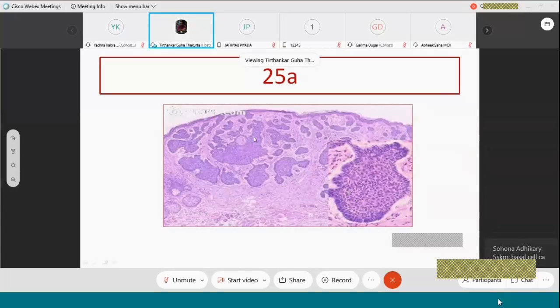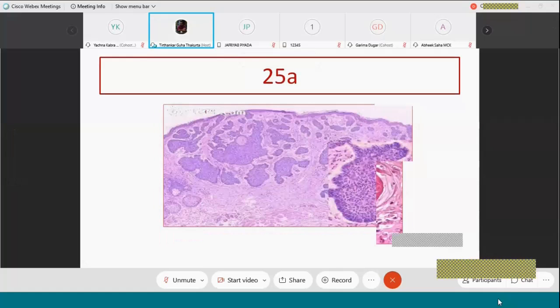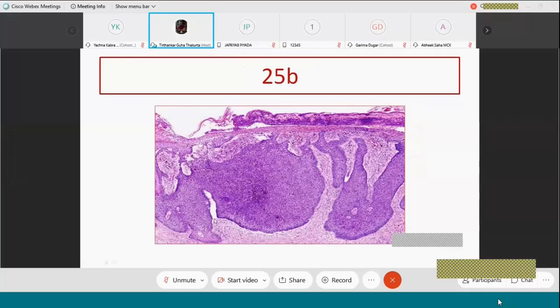So the squamous cell carcinoma typically originates from the upper layers of the skin, and that is why they are more pinkish because they contain more keratin. The basal cell carcinoma originates from the basal cells. It's more blue in color, and they come down forming dumbbell-like projections, as you can also see here. There's an outer palisading or parallel arrangement of cells and inner haphazard arrangement of the cells. So this is the arrangement of the cells.